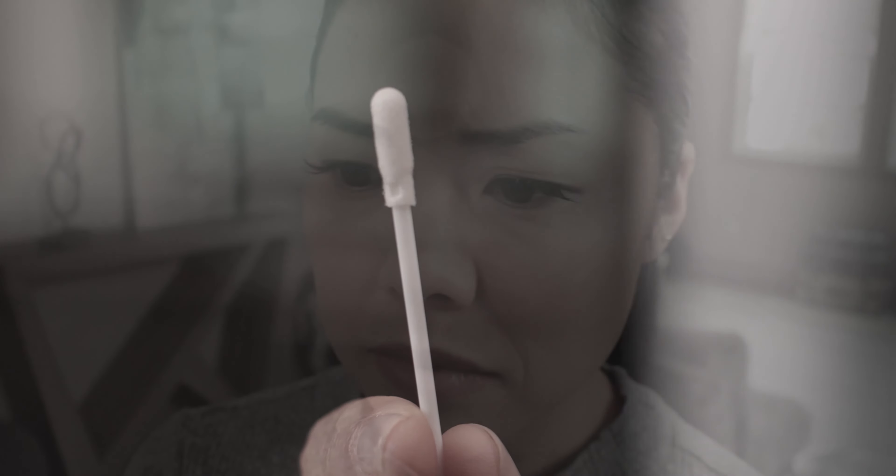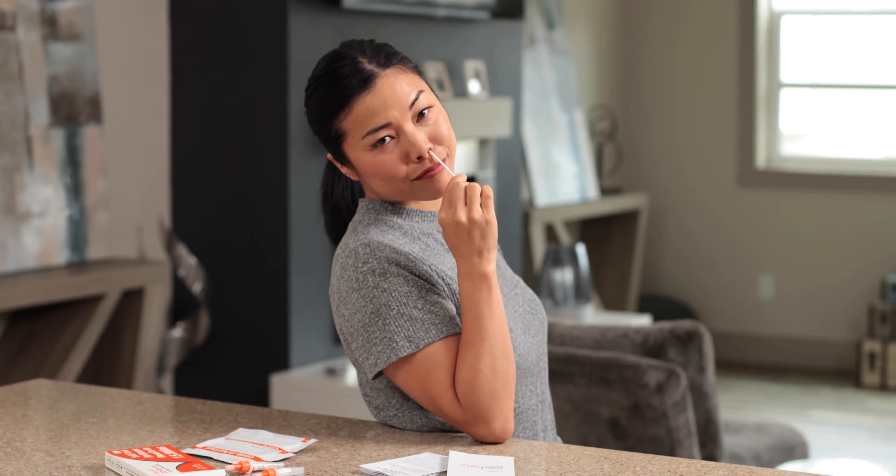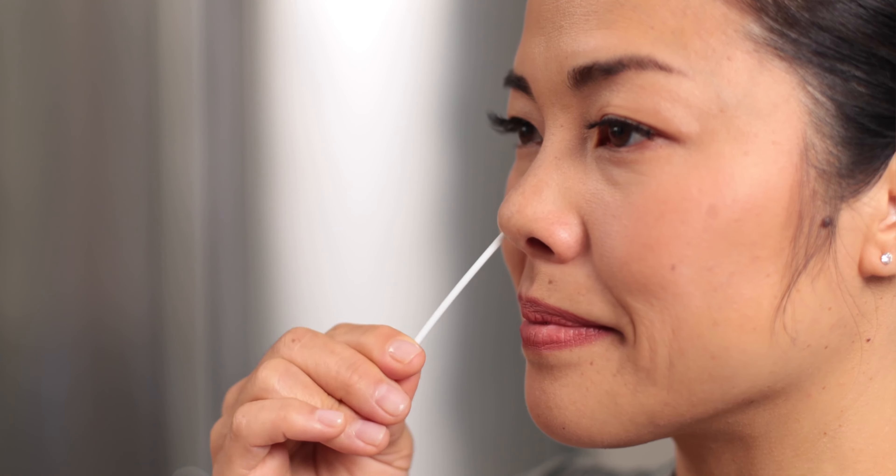Which brings us to the fun part we know you've been looking forward to. Yes, this thing's going inside of your nose. But lucky for you, the iHealth Rapid Test Swab is specially designed for simple, comfortable testing. It barely has to be inserted into the nostril — about a half to three quarters of an inch. Easy. In a circular motion, swab as if you were cleaning the inside of your nose. Note that this is not a matter of simply twisting the swab in place.